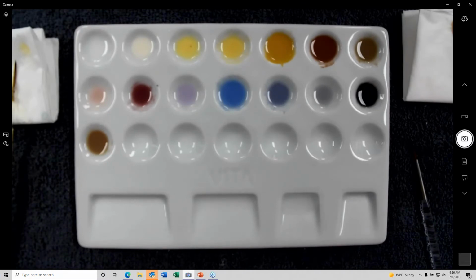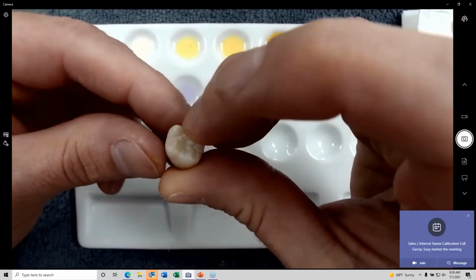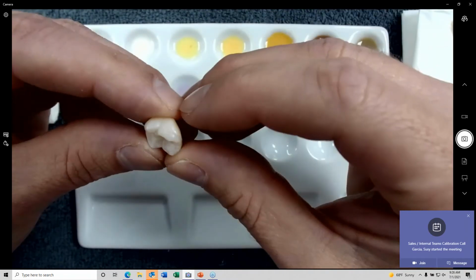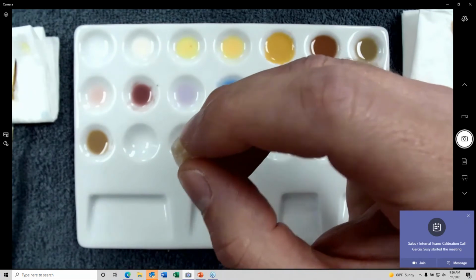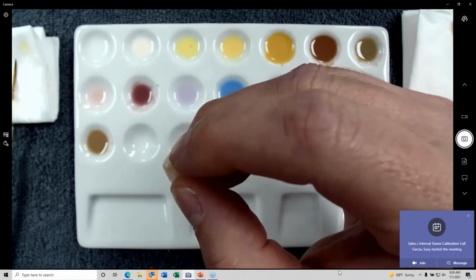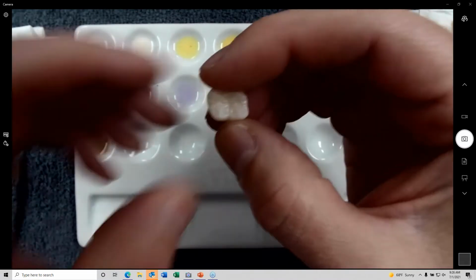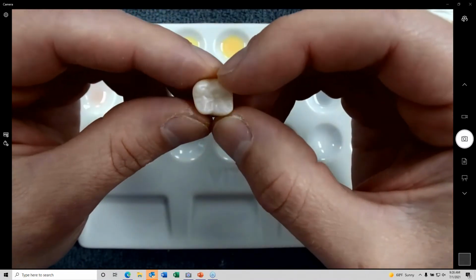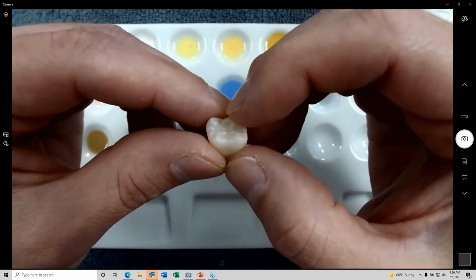finishing zirconia. So zirconia, even after we've sintered it, okay? The surface finish of zirconia is actually still very, very hard and very, very abrasive. So we want to make sure that we don't have raw zirconia against natural dentition.